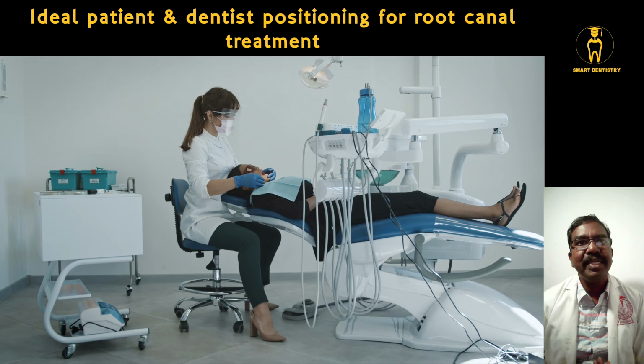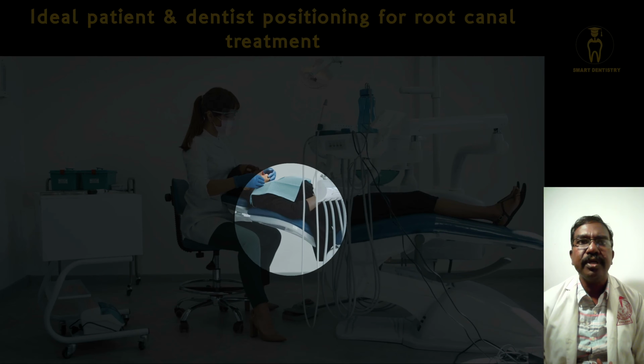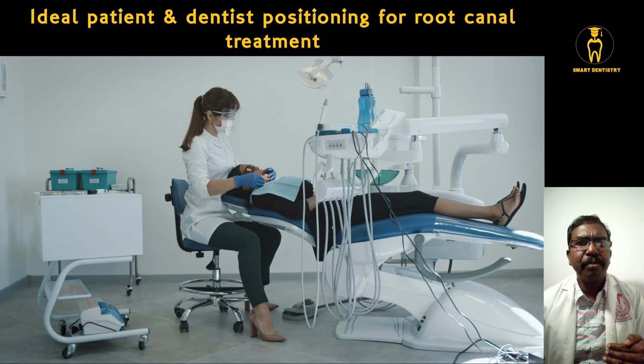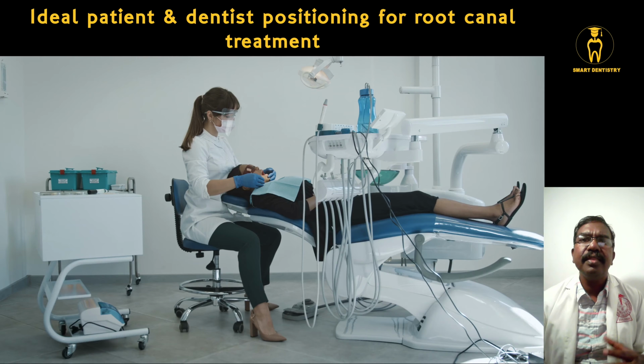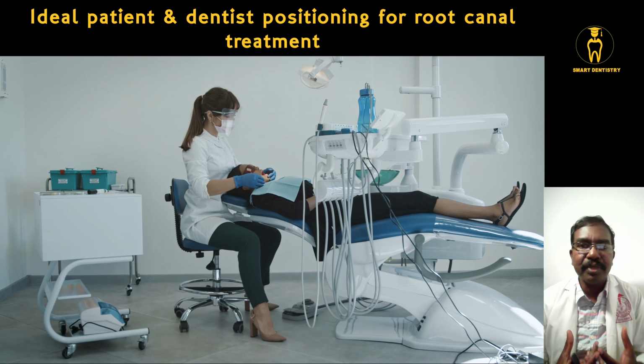We can see that the patient is lying almost flat in the dental chair. Make sure always the patient lies flat in the dental chair while doing root canal treatment. Why is it? People often say that for mandibular teeth we have to put the patient in an upright position so that it will be easy. No, but I would say try this out. This will give easy accessibility to all the teeth in the oral cavity.